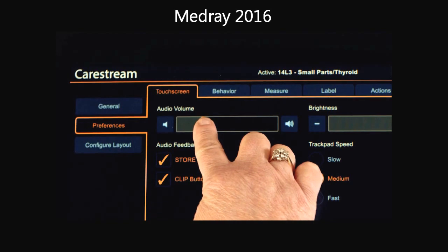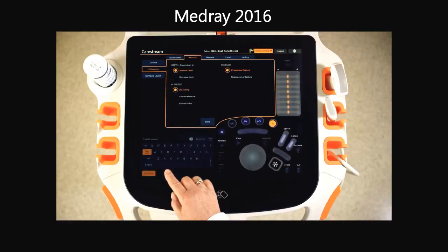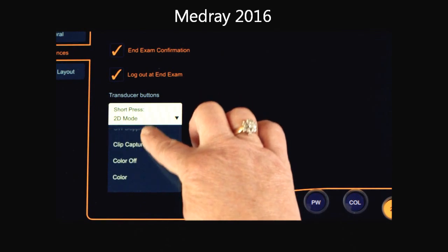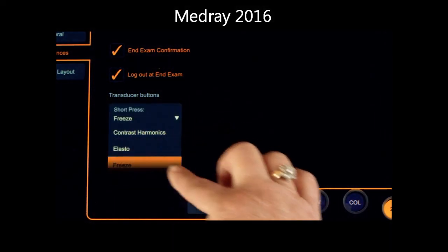Setting up brightness and audio feedback preferences, programming how depth controls behave, selecting a keyboard or word library to display, and customizing the action of the smart select button on your transducers.